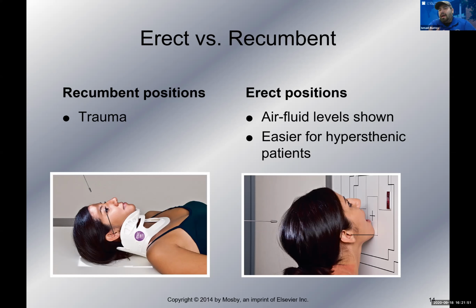So in order to help that out, if you do them in the erect position, we can adjust them to get that head closer to the image receptor while keeping the body away, okay? Now, if it can't be done erect, just do it recumbent and do your best to try to minimize that OID.